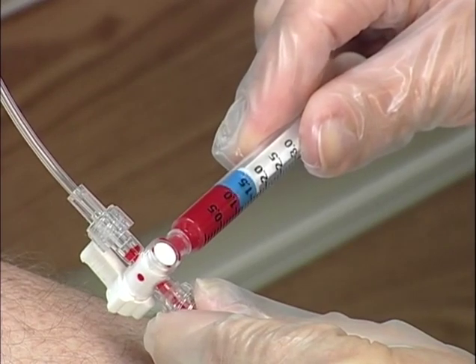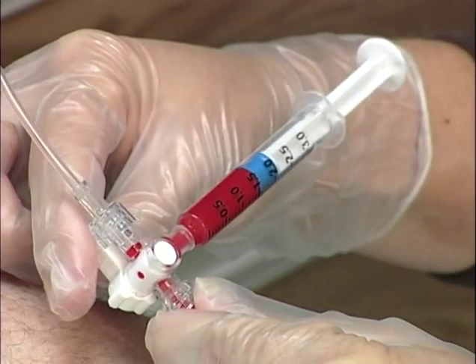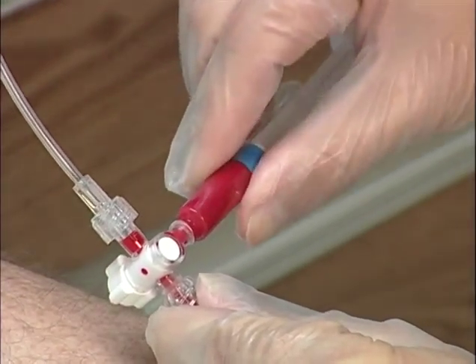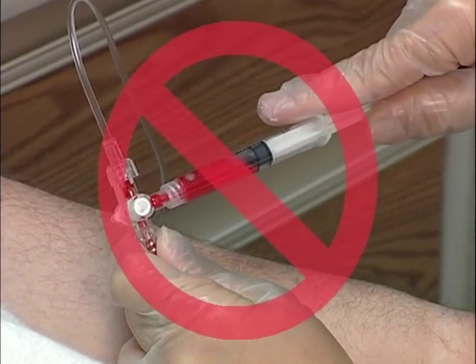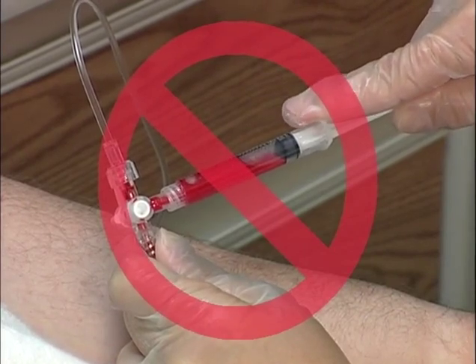Remove, cap, and label the syringe. Upon completion, the line should be flushed and any infusion resumed. Avoid forceful pulling on the plunger of a syringe as it subjects the specimen to subatmospheric pressure and may alter test results.